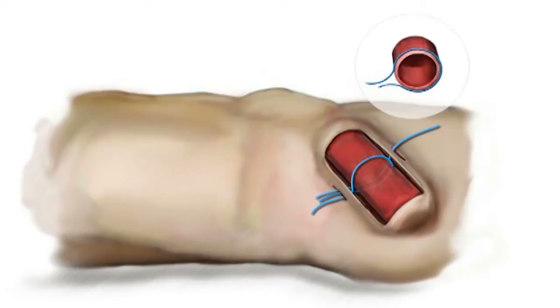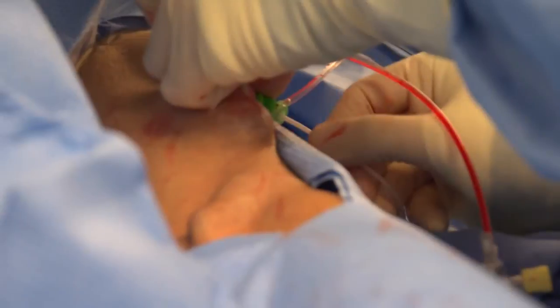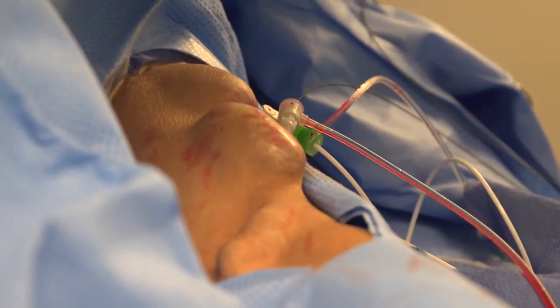The only thing to be wary of is significant scar tissue in the area, which will make the dissection much more difficult. Every time I start a case I get two accesses: one toward the inflow to perform the banding, and one toward the outflow where I position my flow catheter. I place the flow catheter and leave it in its exact place without moving it for the entire duration of the procedure, so every flow measurement is taken from the same position.